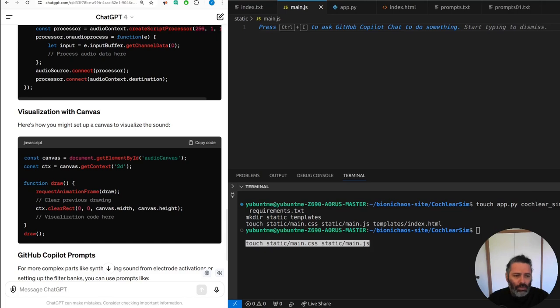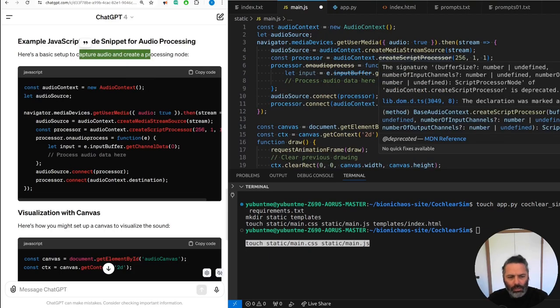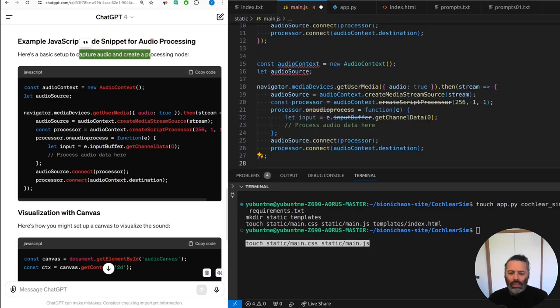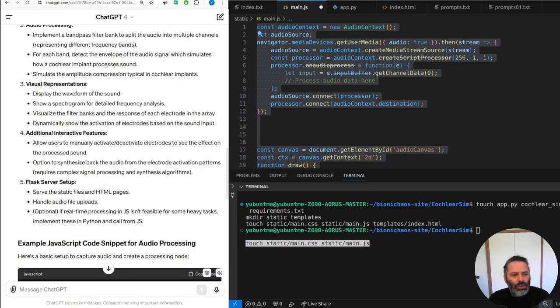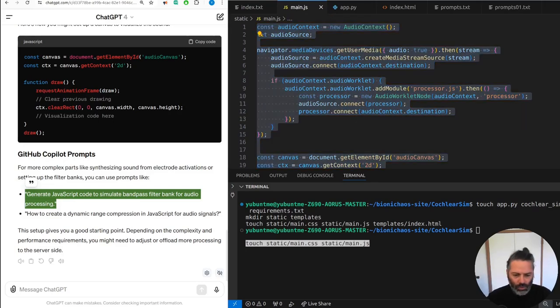Workspace: you can use the following JavaScript to capture audio and process it. Kind of similar to what the GPT-4 generated as well, didn't it? Declaration was marked as deprecated, and it's not good. That's exactly the same. How come? It's just taking some existing example. Use the AudioWorklet interface instead. AudioWorklet, worklets, really weird name. It's giving us some prompts for Copilot.